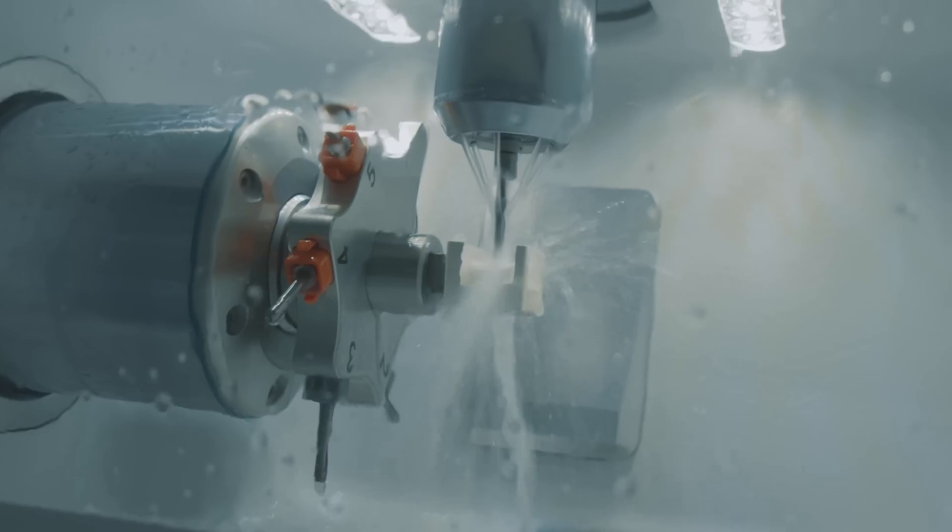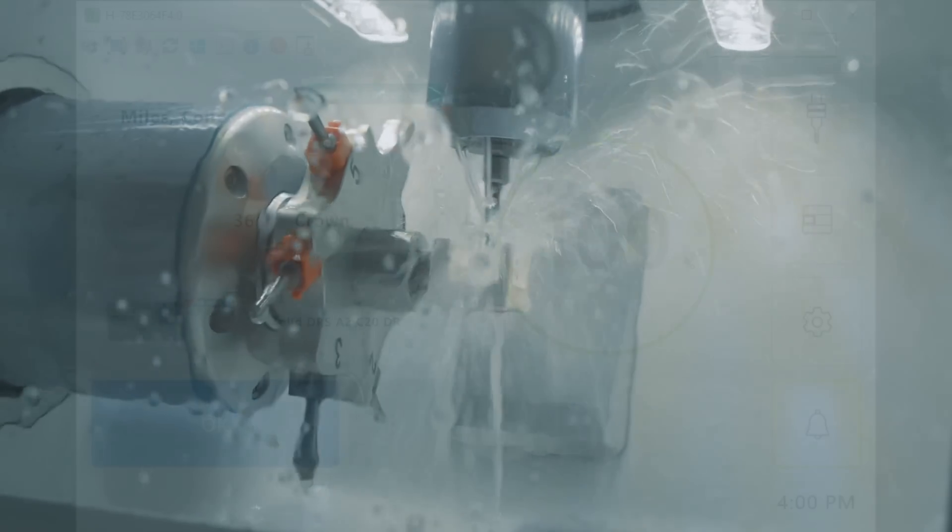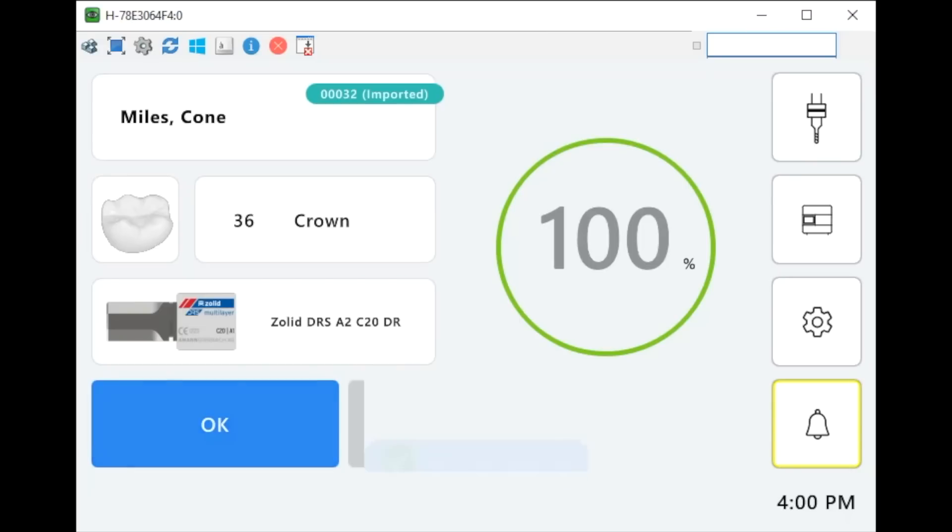The crown is capable of being milled in only 15 minutes, so it's now possible to offer restorations during a single visit. The machine will let you know when the milling process is done.